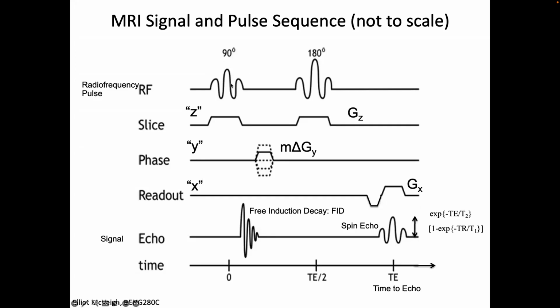Each one of these radio frequency pulses is provided by our transmit coil. The times between these pulses are on the order of tens of milliseconds in a standard old school spin echo pulse sequence. When I started in MR, everybody used these because it was the only way to get a signal big enough to make an image, since the magnets were weaker than 1.5T. When I started, we had a 0.15T magnet, which means the signal was pretty low.